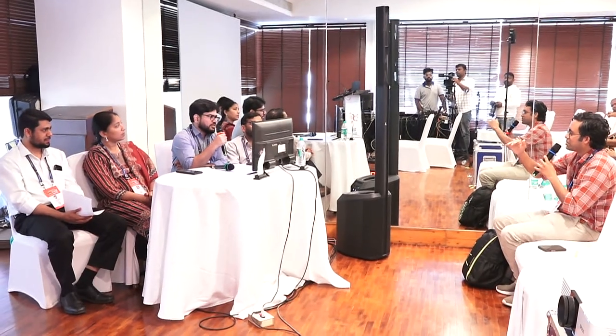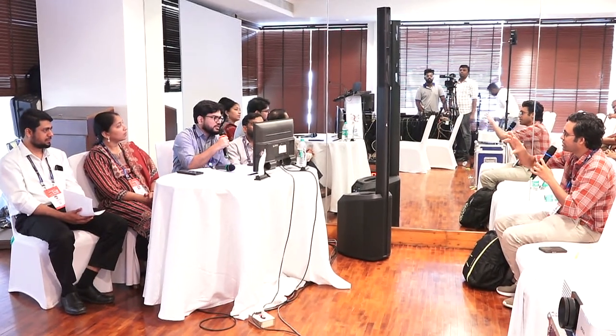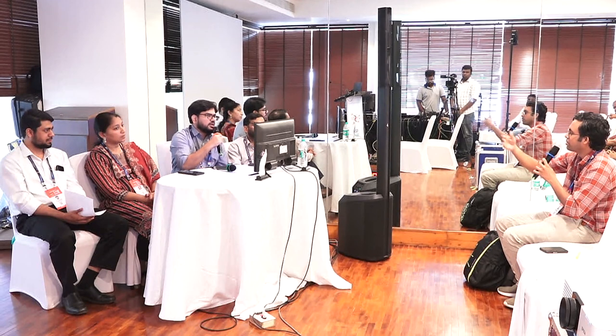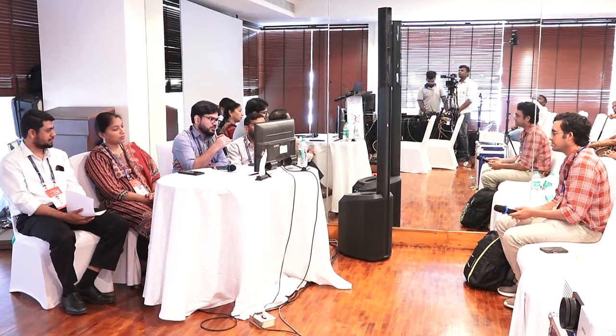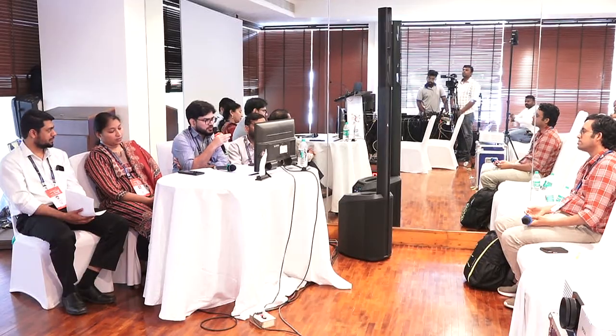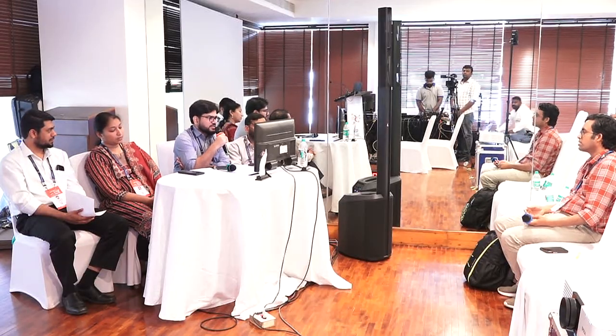Sorry to interrupt. I was being a little more specific regarding the OCT part. Like, how would you like to monitor? Okay, once it is a diagnosed case, I refer to the neurologist, and they start the treatment. I will follow up the patient at 6 weeks.